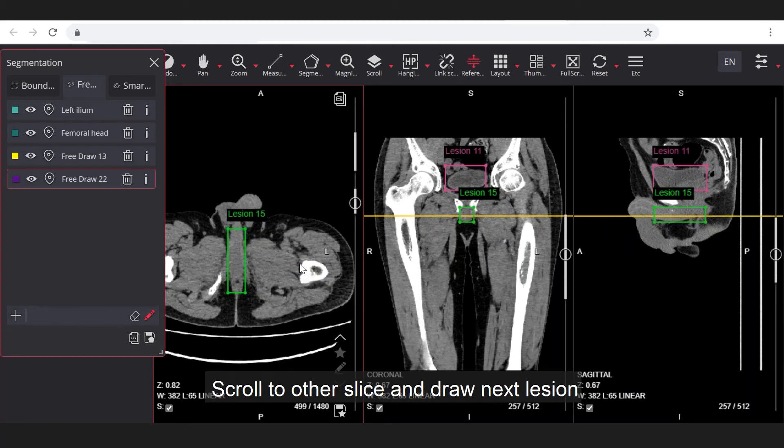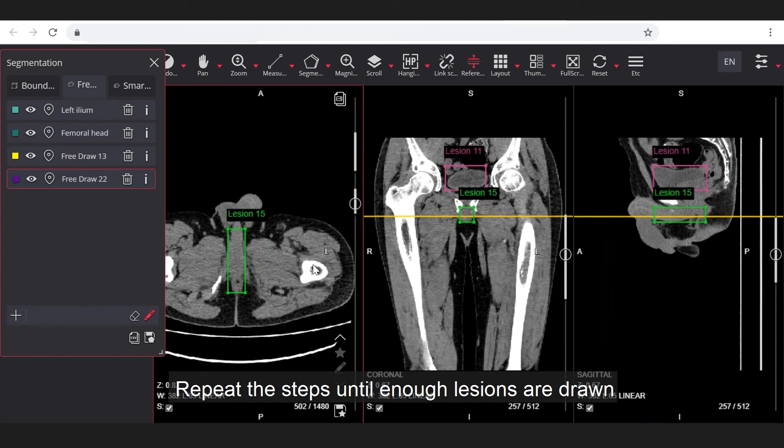Scroll to other slice and draw next lesion. Repeat the steps until enough lesions are drawn.